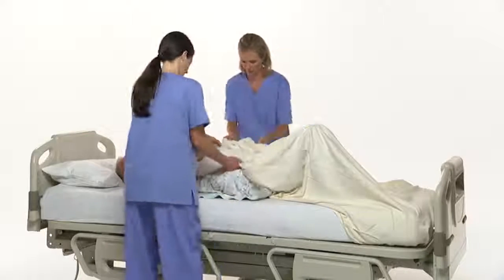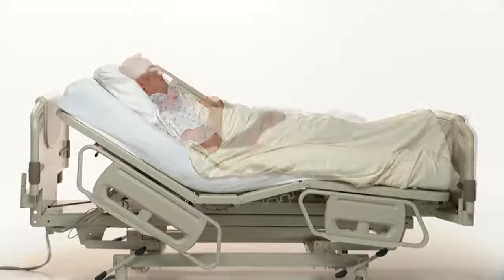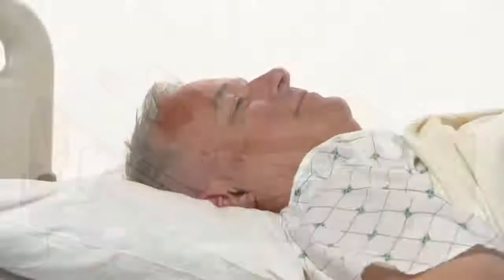For over 100 years, caregivers have struggled with the challenge of pulling their patients up in bed. This problem occurs when the head of the bed is raised and gravity forces the patient to slide down to the foot end of the bed. It's a problem that places both the caregiver and patient at risk, and unfortunately these situations can occur multiple times per patient every day.